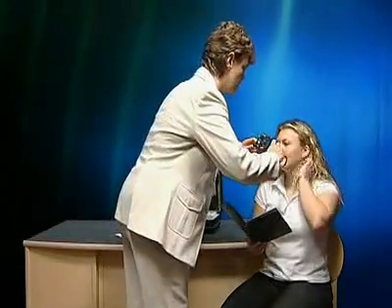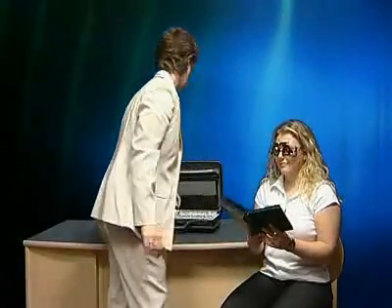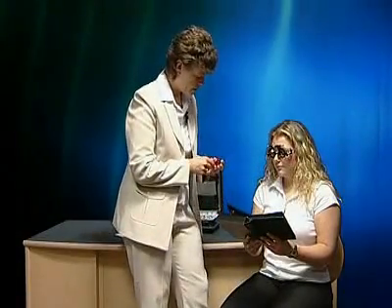We're going to pop a trial frame on, because all of our filters come in trial lens size. I would normally start with the warmer colours in the filters, simply because we find these tend to give us the best results. You are welcome to take it through all of the colours, but I would suggest starting with the warm ones. Looking at these two plates, I just want you to tell me if anything becomes clear or apparent with any one of these filters.